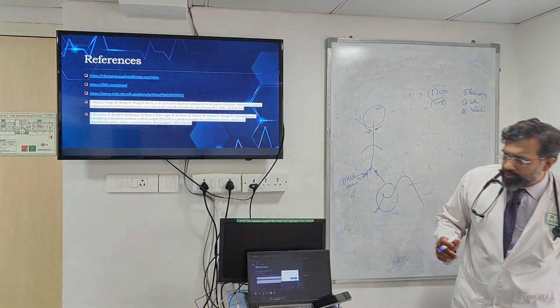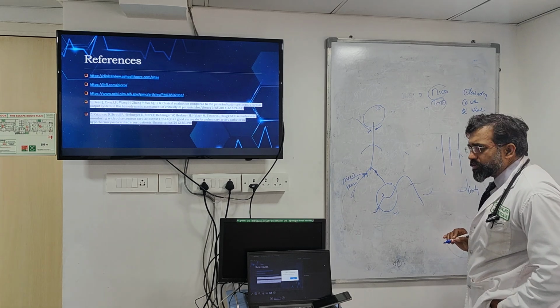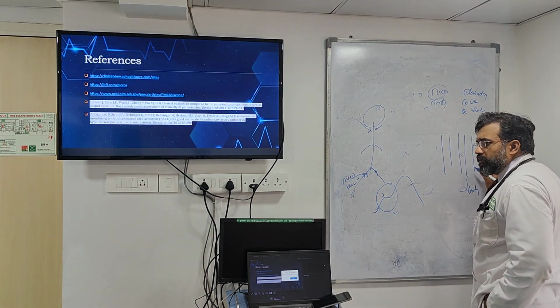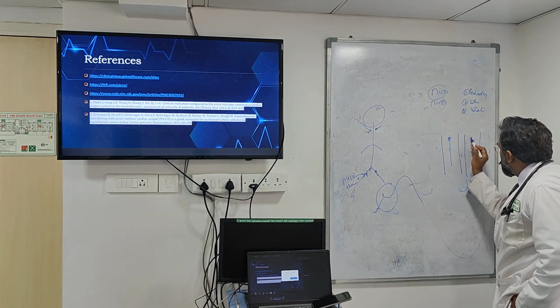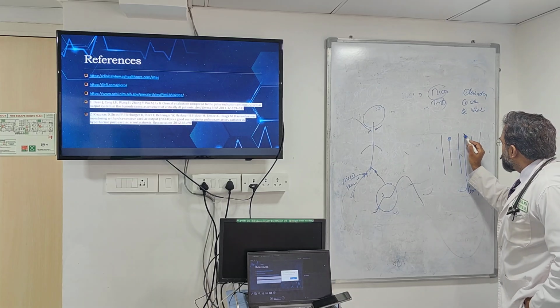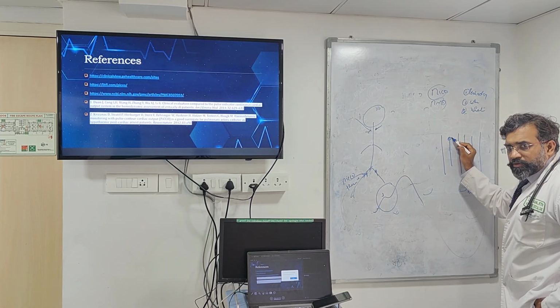See, you have an artery, right? The thermistor is lying like this in the artery. For example, you have a vein. The vein is lying over here. Now this is occurring because the thermistor that is over here is very close to this. So when I am injecting from here, the thermistor is immediately picking it up, and that's why it's causing this hump over here.